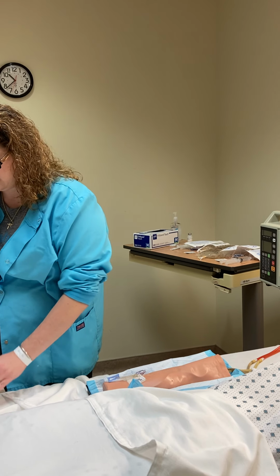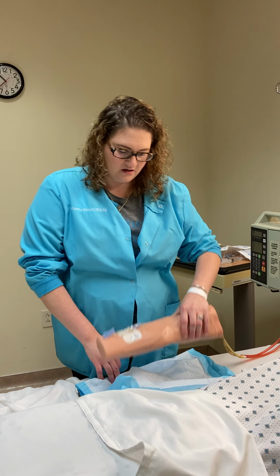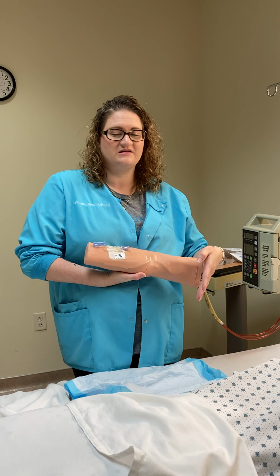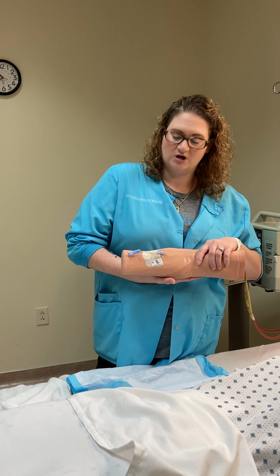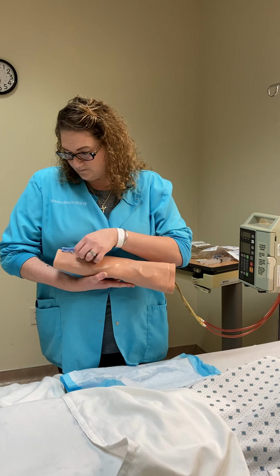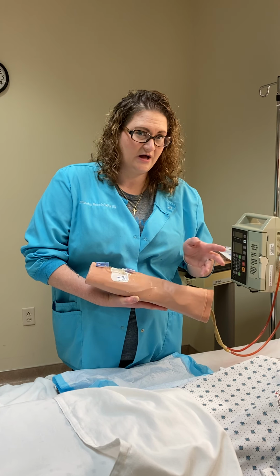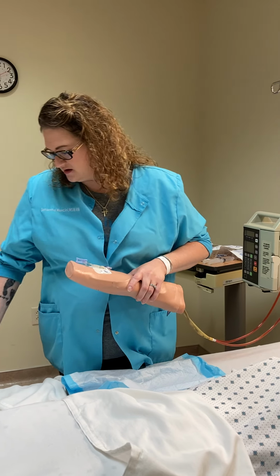All right, so for our IV assessment, it should tell us in the chart where we're at, but also we get it in report, and then when we assess our patient, we know where our IV site is. So we're gonna say this is in our right forearm. It's a 22 gauge. It was just placed today at 10 a.m. We would want to note any redness, swelling, oozing from the site, whether it's blood, whether it's something that could be significant for an infection.